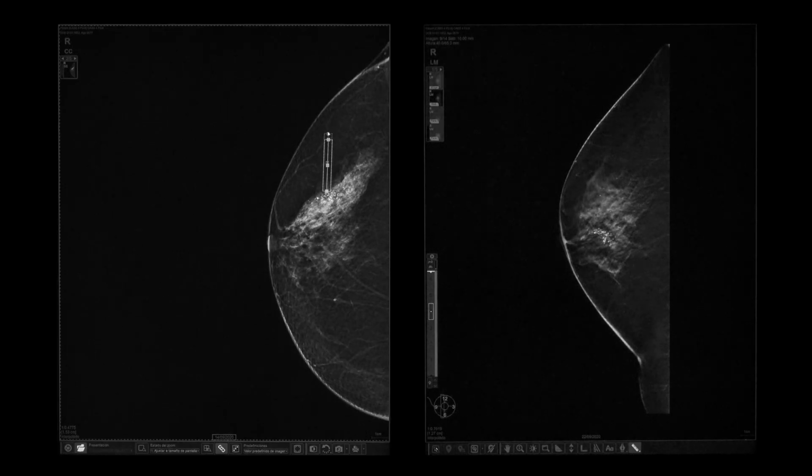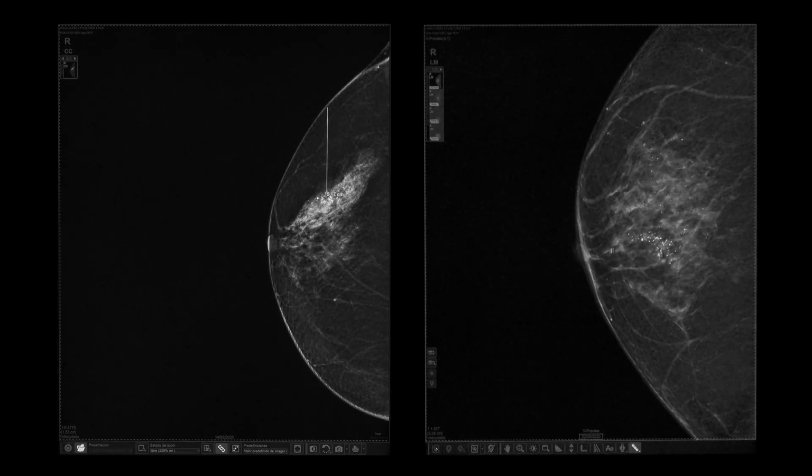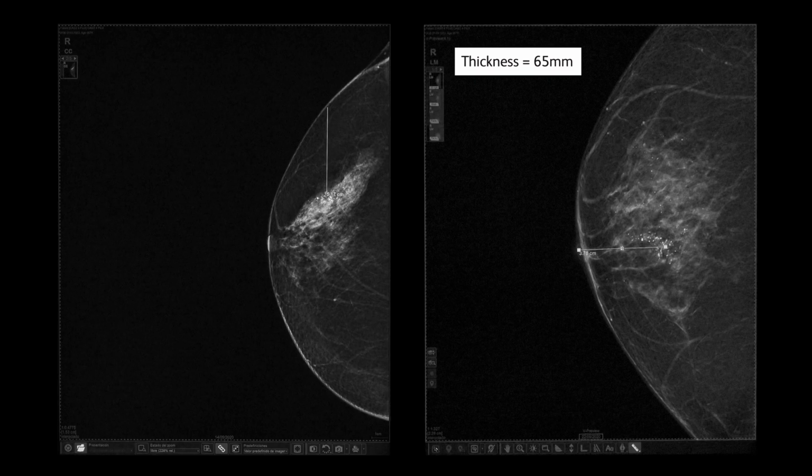In the craniocaudal view, draw a straight line from the lesion to the skin, outer quadrant. This is 5.17 centimeters. Sitting position, horizontal approach, external access could be a possibility. In the lateromedial view, draw a straight line from the nipple to the lesion. This gives 3.78 centimeters. Since breast thickness would allow a vertical approach, and considering patient comfort and shortest approach, lateral decubitus external access is selected.